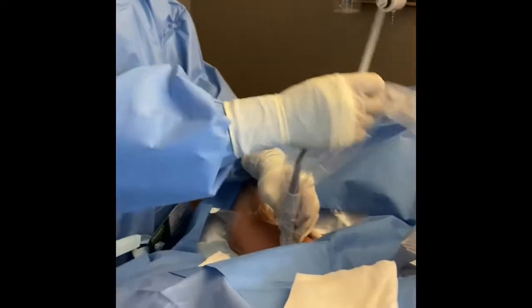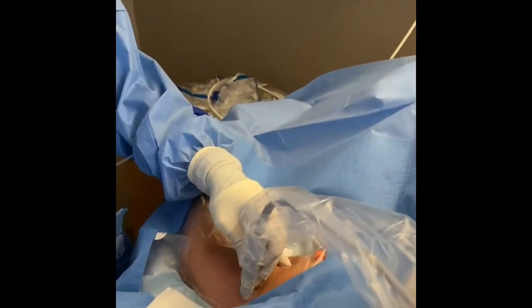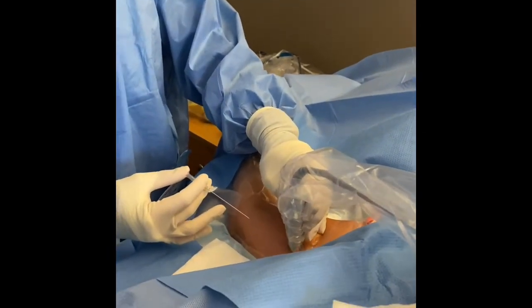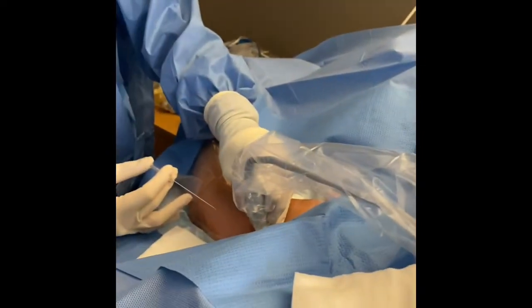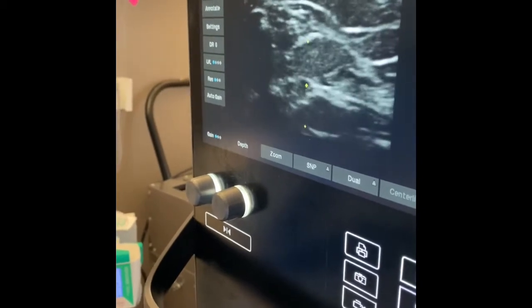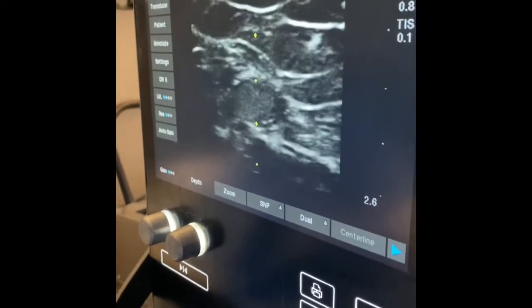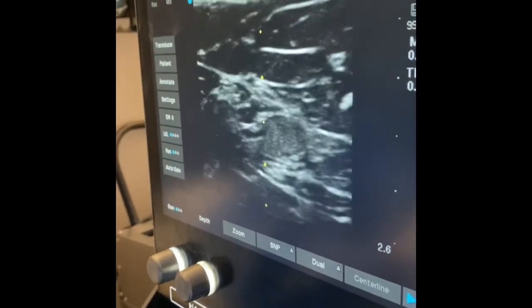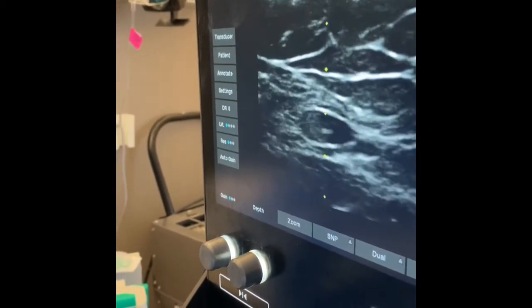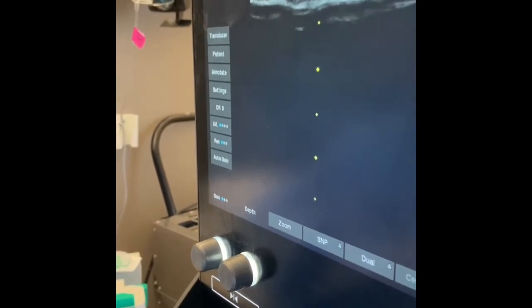Are you okay? Now he's going to access the vein. I'm going to show you once he's nicked the skin — we're going to switch the view to the ultrasound. Make sure your needle is at the center. You're going to feel the poke. Very good — you're almost on top of the vein. There you go, you are at the center of the vein. Slide the needle down a little bit and thread it through. I already threaded it through.